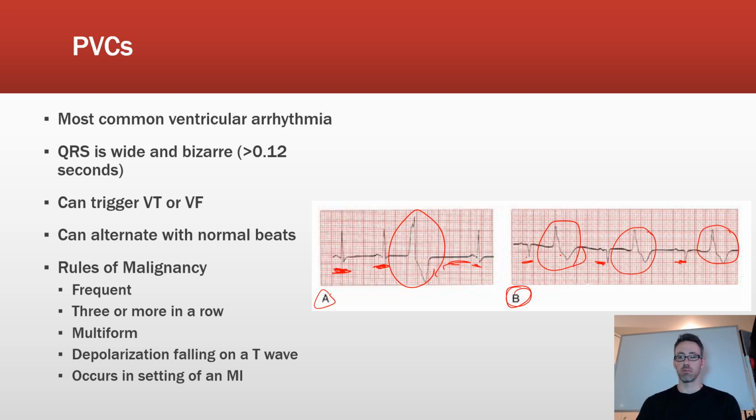And we'll talk more to that in some of the other examples, but this ectopic beat could occur. Typically, if it's going to occur on a T wave, it's usually if the QT interval has been prolonged. So the longer the QT interval, the higher the risk that something like an ectopic beat could occur at the same time as a T wave and cause the person to go into VTAC or VFib.